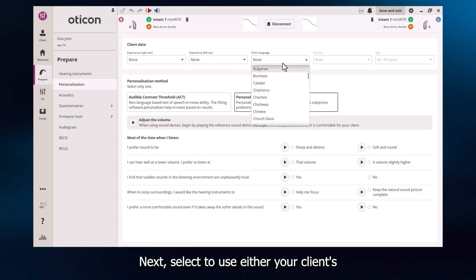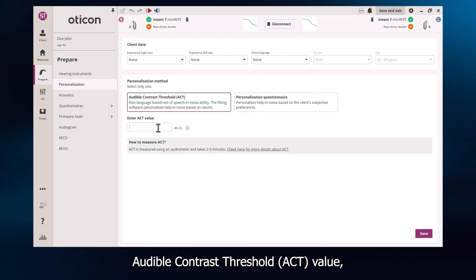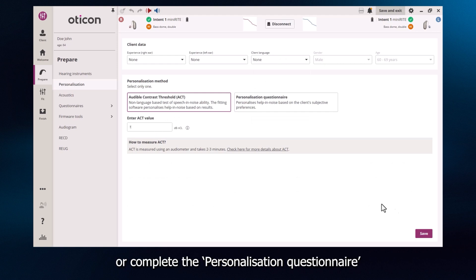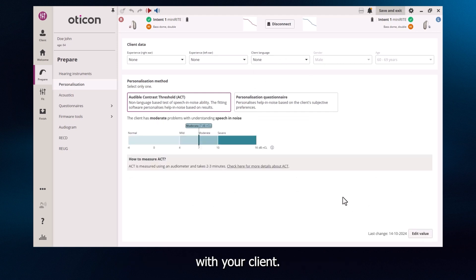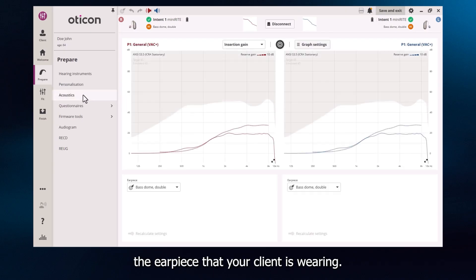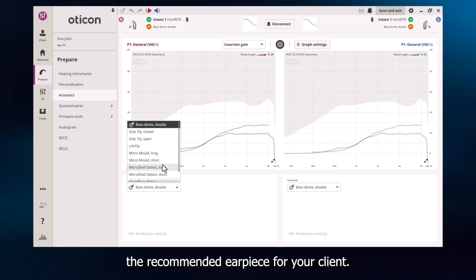Next, select to use either your client's audible contrast threshold value if you have one, or complete the personalisation questionnaire with your client. Now, move on to acoustics and select the earpiece that your client is wearing. The target icon highlights the recommended earpiece for your client.